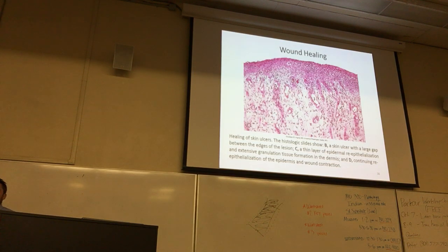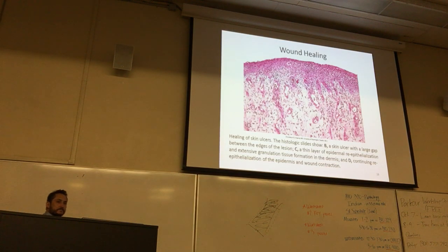Now, what are some characteristics that tell you this is granulation tissue? Let's say I showed a slide like this on the exam and I asked you what phase it was in your wound healing response.